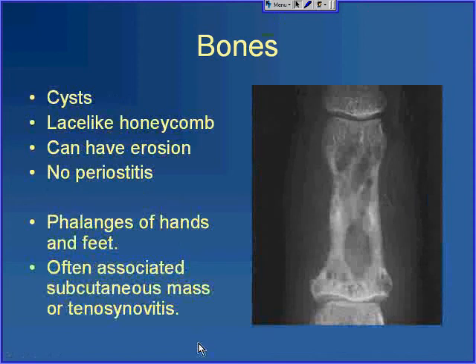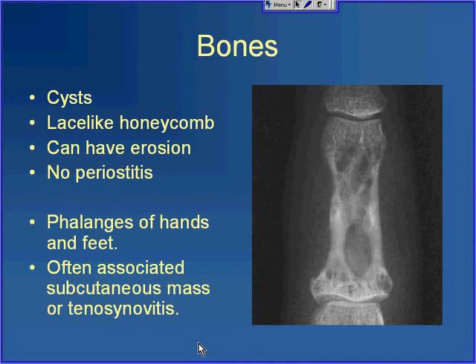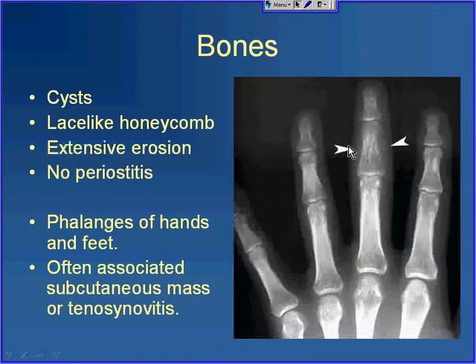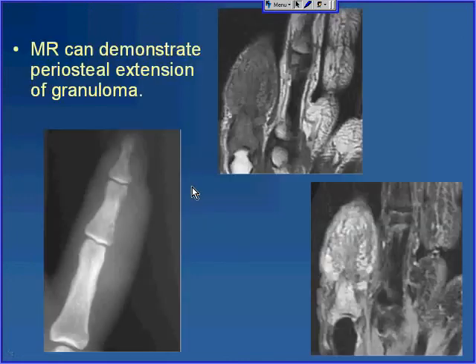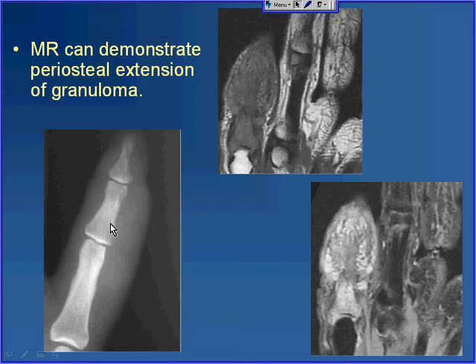Typical bony involvement, particularly in the phalanges of the hands and feet, consists of multiple cysts within the bone giving a lace-like honeycomb appearance. There can be erosions, but periostitis tends to be absent. Associated subcutaneous masses or tenosynovitis can occur. In one example, there is a soft tissue mass and intramedullary cysts with that lace-like honeycomb appearance. In another example, soft tissue swelling and erosion along the radial aspect are visible with the same typical lace-like pattern. MR can demonstrate soft tissue changes due to periosteal extension of the granuloma outside the medullary cavity. One patient initially thought to have gout had a tiny cyst and soft tissue mass that was proven sarcoid on biopsy.